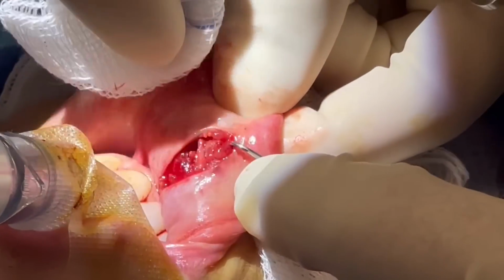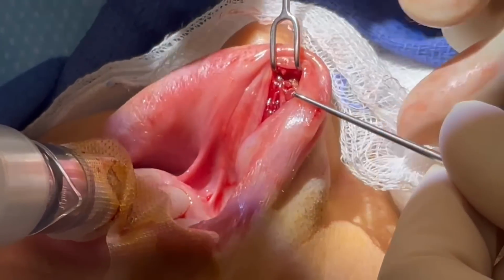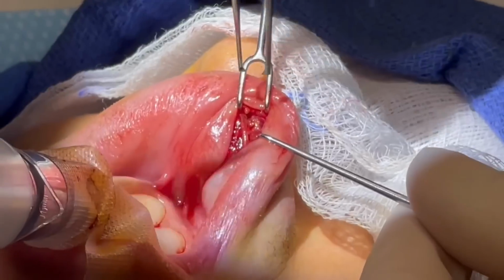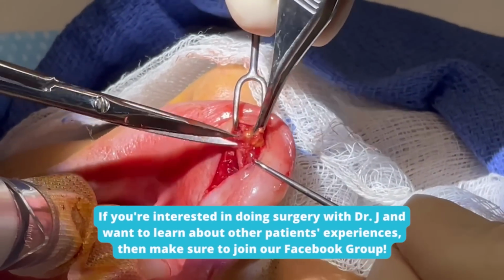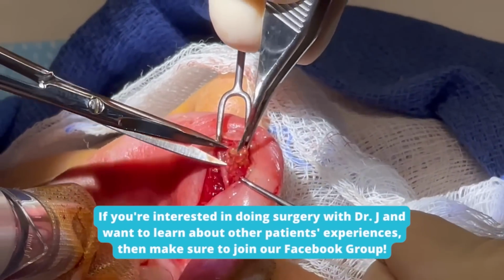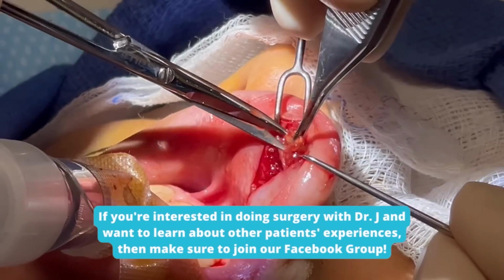So now I'm gonna have you. Perfect. Right there is. Wasn't sure if that's sac or something. No, you found it.